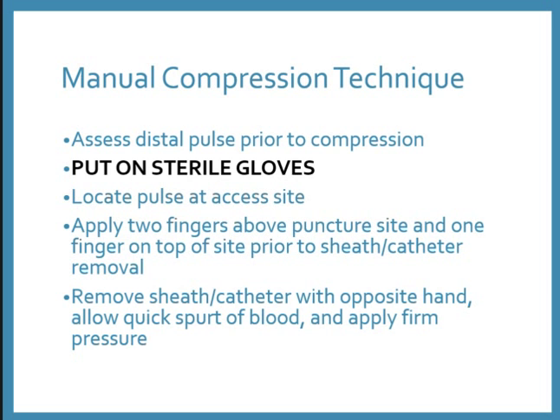Another thing to note: we see the skin insertion site, but the actual insertion of the catheter into the artery is located above the skin site, probably about two fingers or so. The actual site that we need to hold pressure on is where the catheter enters the artery.